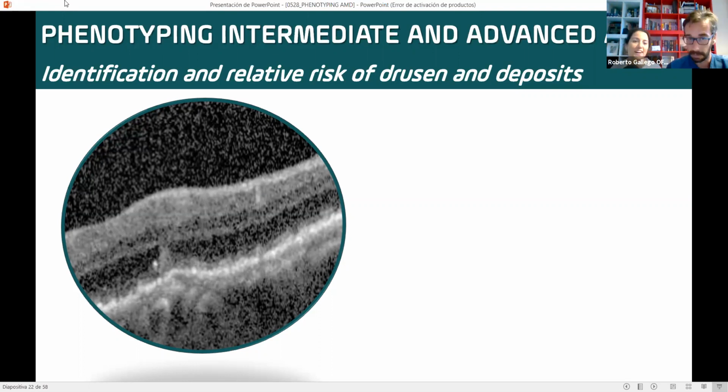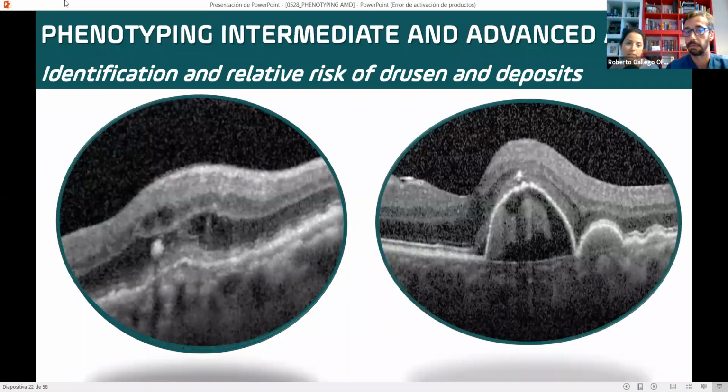Is that columnar hyperreflectivity meaning something at all? Maybe, but I don't see exudation. There's a hyperreflective focus next to this column. I will bring you this patient one month later. I will follow up carefully to see if it's an early type 3. But it was. Okay.